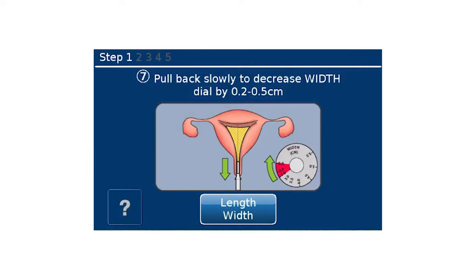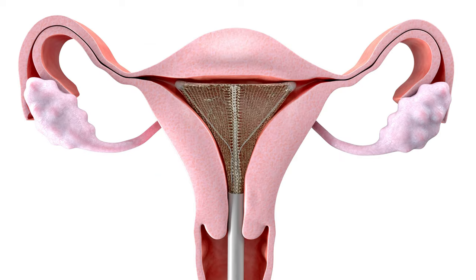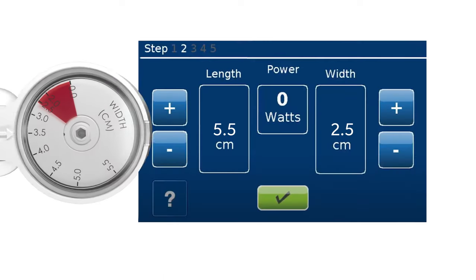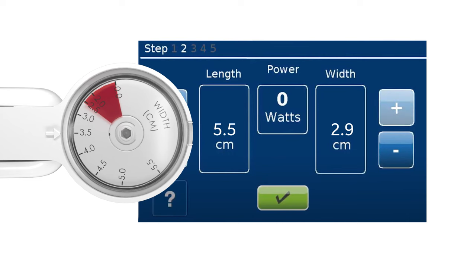To complete placement, slightly pull back the device until the width dial reading reduces by approximately 0.2 to 0.5 centimeters. Then advance the NovaSure device slowly and gently to the fundus. Make sure all movements are slow and gentle. The width dial should read greater than or equal to the previous measurement and should always be greater than 2.5 centimeters. Enter the uterine width measurement from the width dial into the RFC-10 generator control unit using the plus and minus buttons.